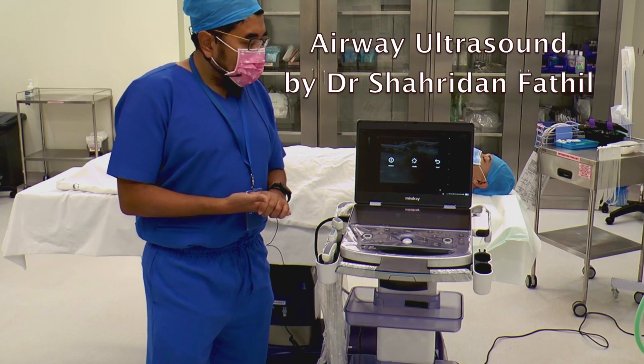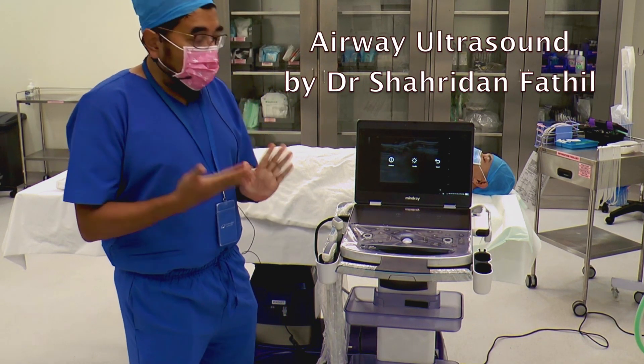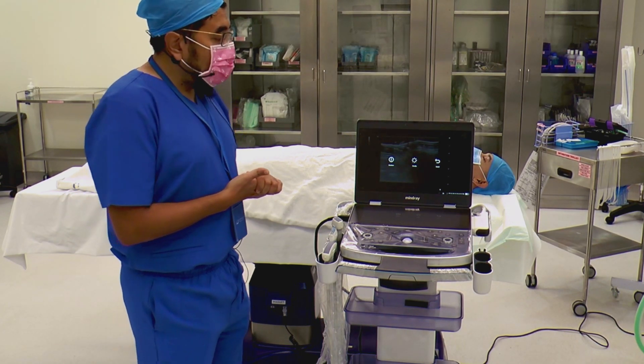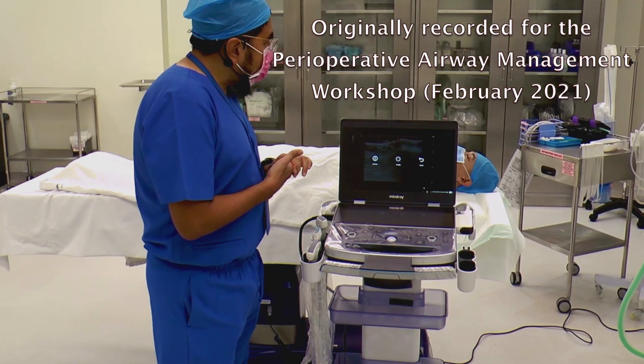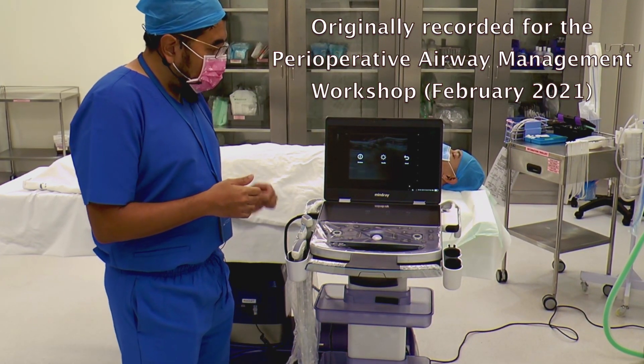Assalamu alaikum and a very good afternoon. I will be demonstrating airway ultrasound. To start off the session, I will show you the knobology of the ultrasound system. We have with us today the Mindray MX-7, one of the latest systems that Mindray is offering.